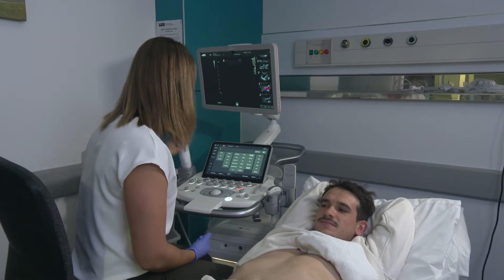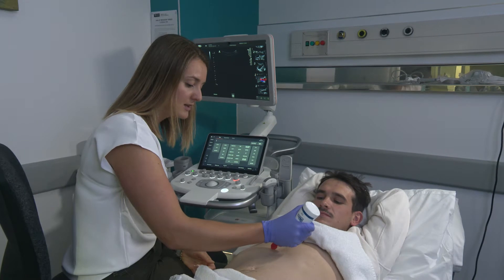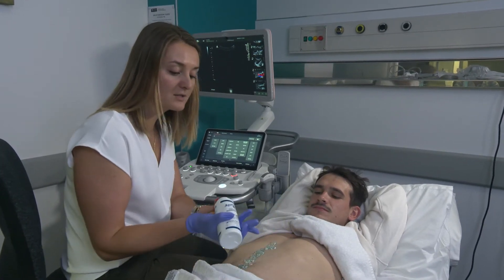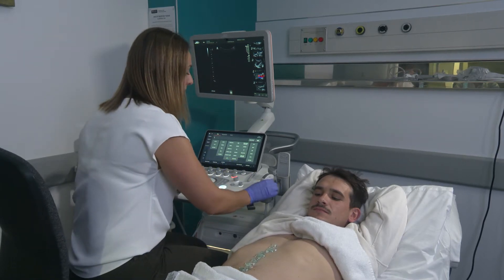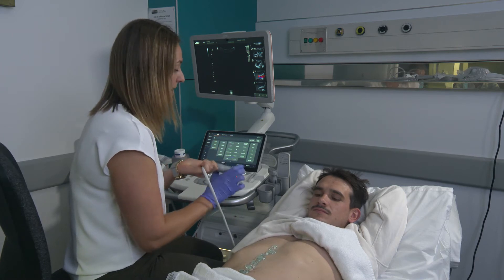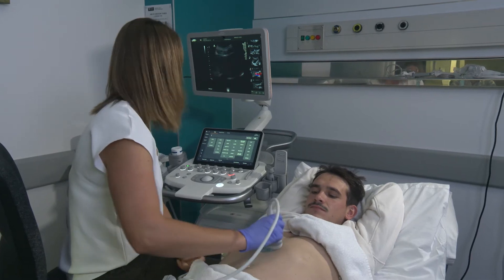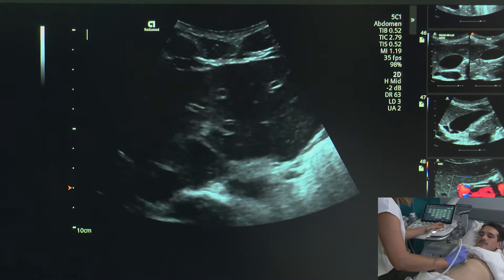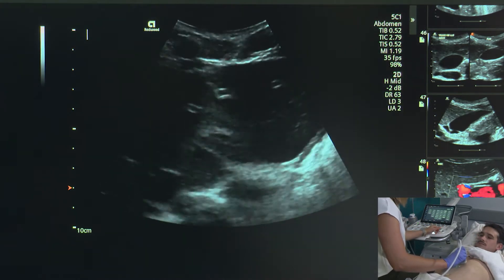When we start scanning, we will start by looking at the aorta, so we're going to look midline. I'm going to apply some gel here in the middle of the tummy, making sure that the tip of the gel bottle does not touch the patient. I'm now going to grab my curved linear transducer, and I'm going to make sure that my orientation is set properly before I start scanning. The first thing I'm going to do when I put the probe down is adjust my depth so that I can see that superior portion of the aorta in transverse.